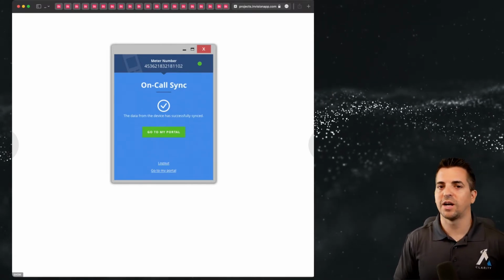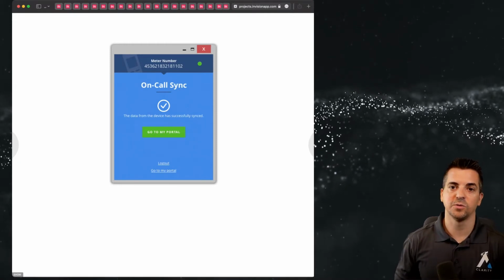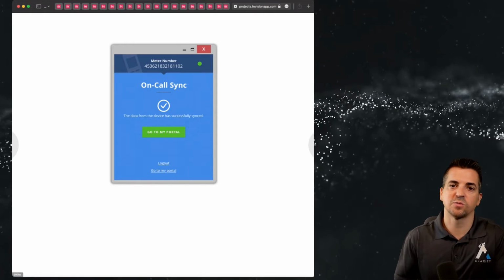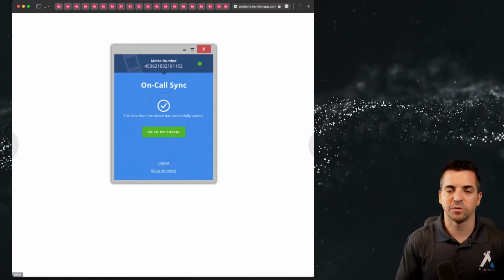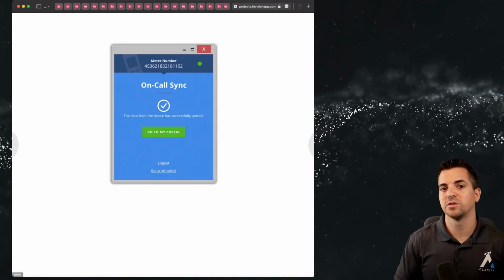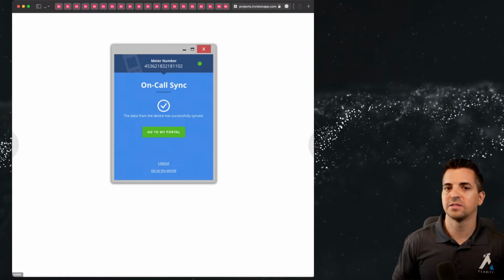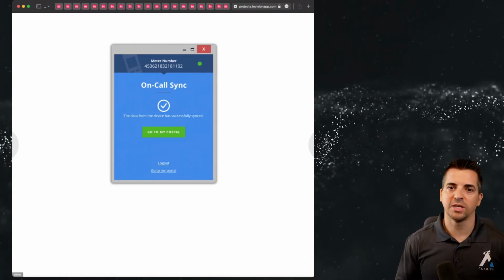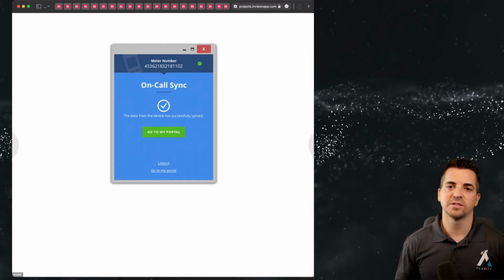Now, we go into a lot of detail in other videos about the dashboard views, the detailed views that are possible, and notifications: how once the data sync is successful, we can notify different related parties who have the right authorization to see those notifications, and just generally make great use of this data once we have it. But the key takeaway is that we can truly work with any type of device to bring data in, and we can do this in a secure way.